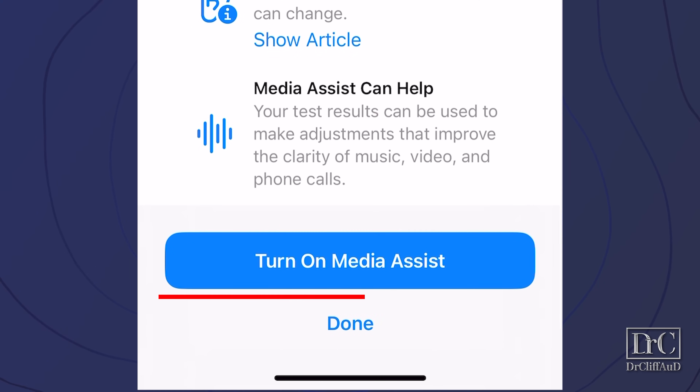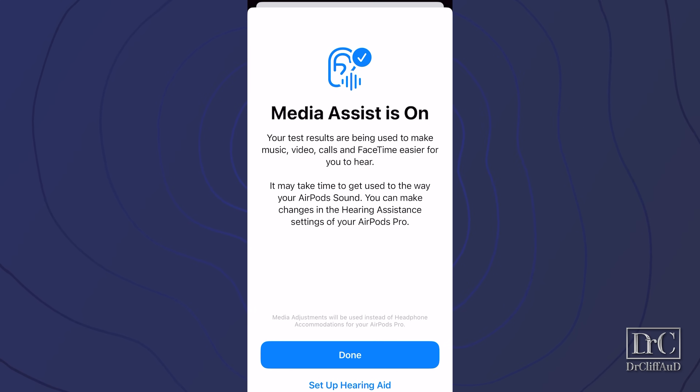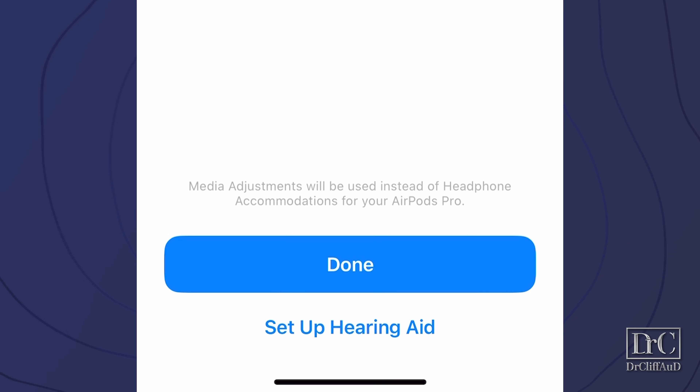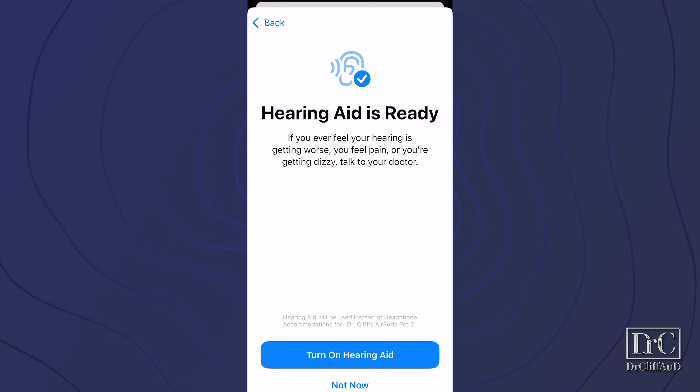You will also have the option to turn on media assist, which will apply your hearing test results to your streaming media as well. When you turn on media assist, it will give you the option to click done or set up hearing aid. You want to click on set up hearing aid. As you click through the options, you will eventually get to turn on hearing aid.